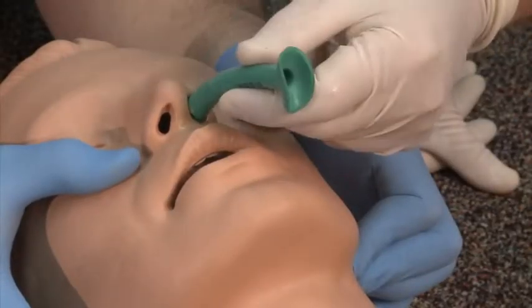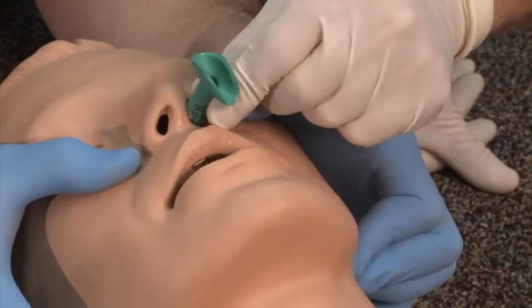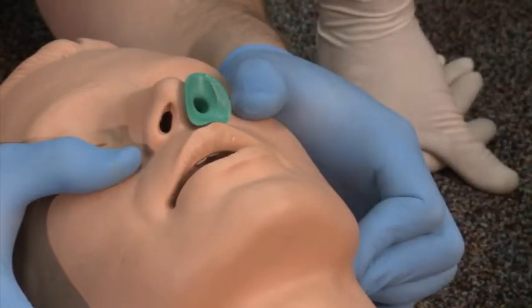The second provider continues insertion until the flange end of the NPA is next to the anterior nares or until the patient gags. If the patient gags, the NPA is withdrawn slightly.